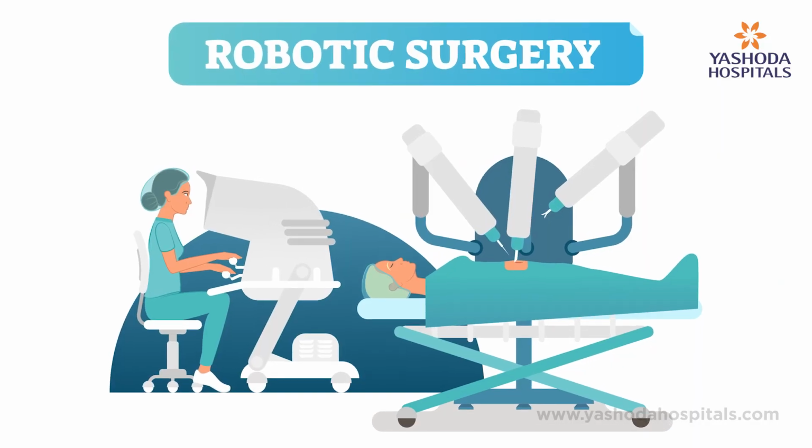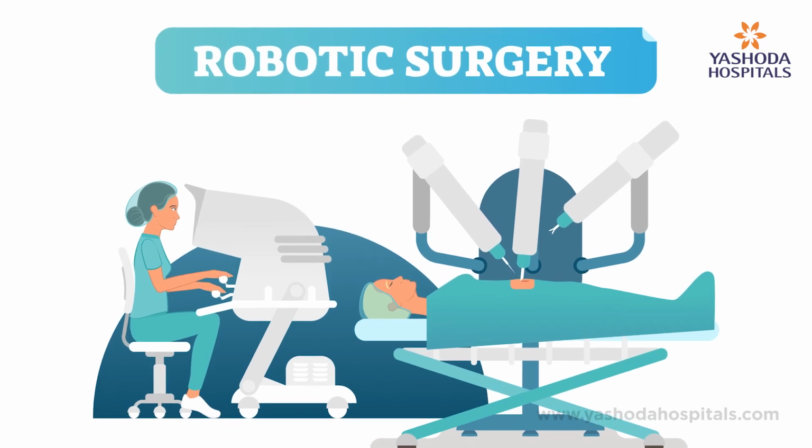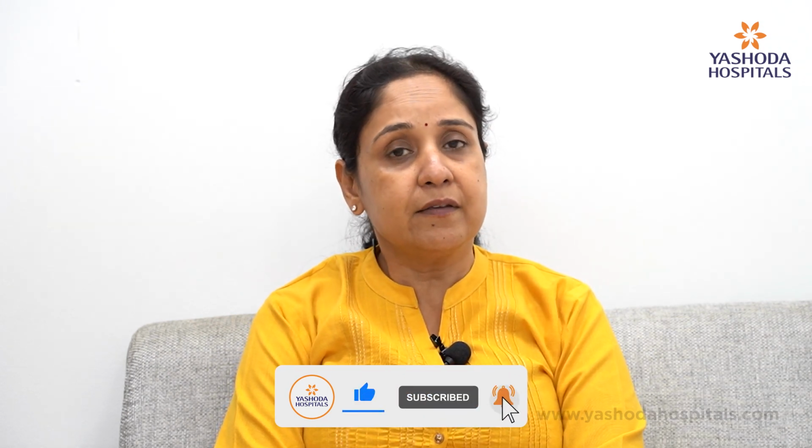When the surgeon sits at the robotic console and controls the robo and does the surgery, a lot of these troubles which I mentioned, which a difficult laparoscopic surgery would cause, are ruled out. So here the patient will have the advantage of getting a very complex surgery done in a reasonably comfortable way, and that also with minimal blood loss, a quick recovery from the surgery and a quick return to activities. This gives a lot of advantage both to the patient and to the surgeon who is operating.